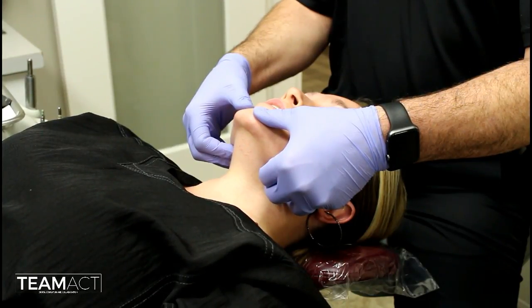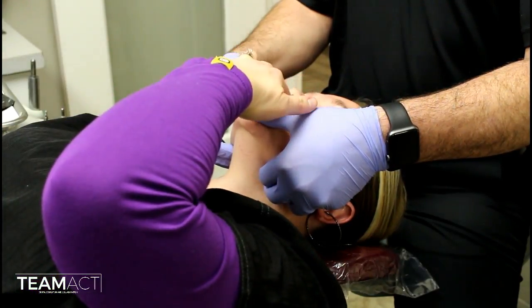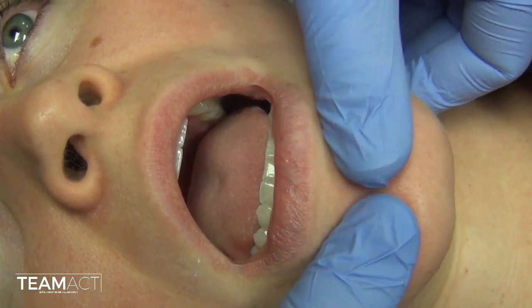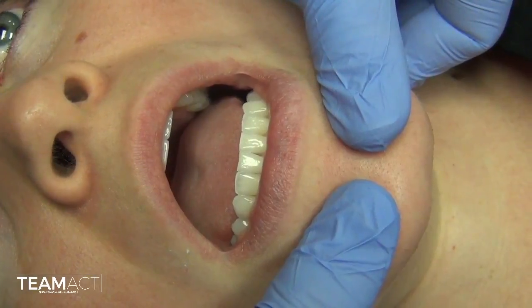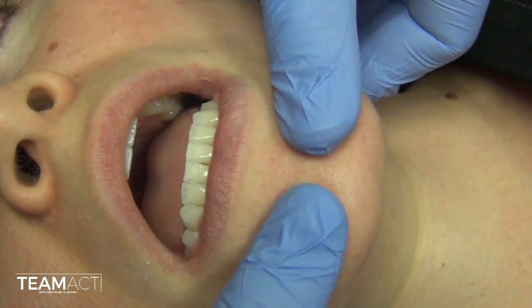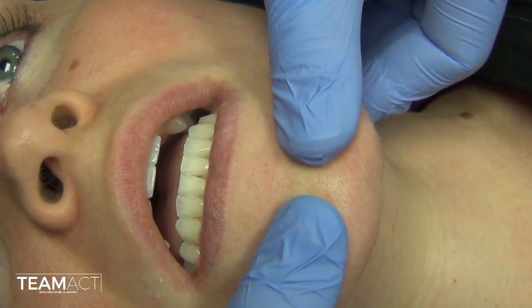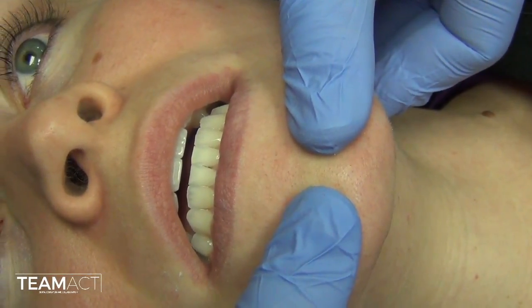When you feel that, instruct them to close lightly and slowly and identify where their first tooth contacts. Repeat this several times until you are confident you have identified the CR first tooth contact position.